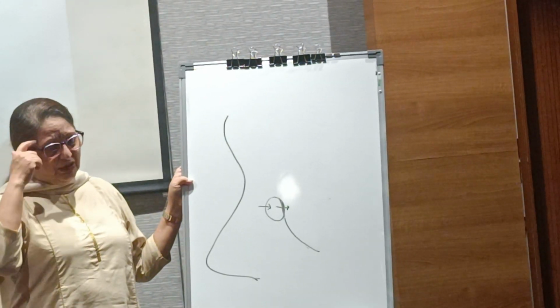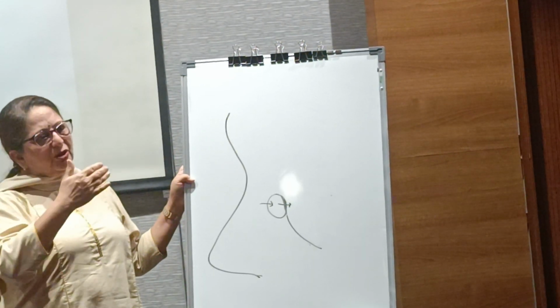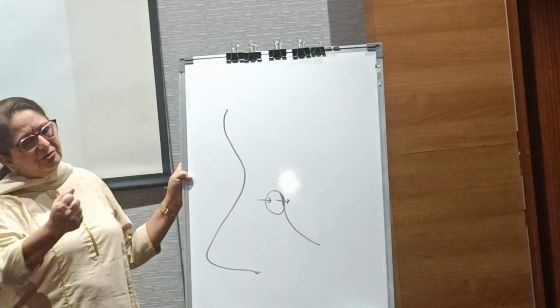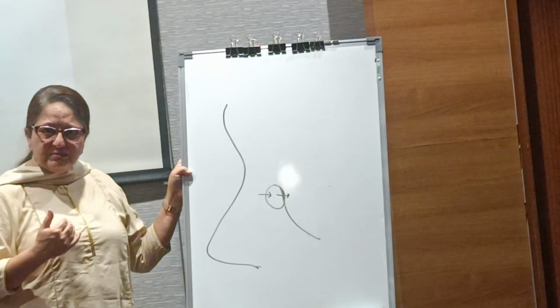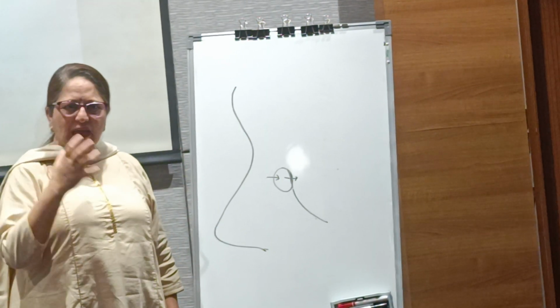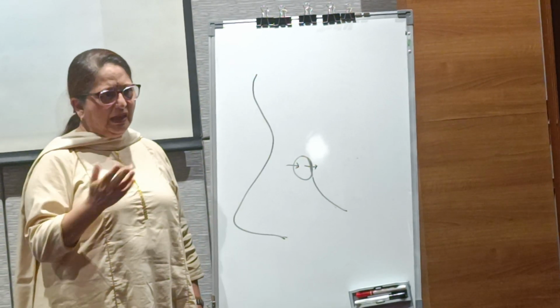So that is what you need to know when you're removing the cell. If you don't see an uncinate, that's because both of them were fused, and when you remove the posterior wall of the agger nasi, you also remove the upper part of it. Does that make sense? There will be times when you remove the posterior wall of the agger nasi and you'll see the uncinate, but there will be times when you remove it and you'll not see the uncinate. Okay? Now does that make sense?